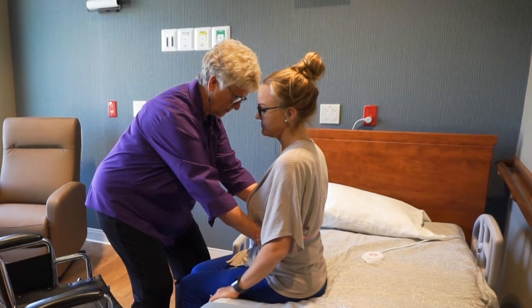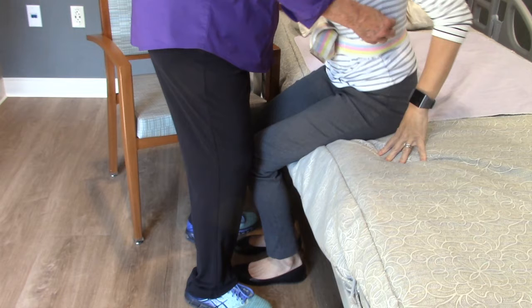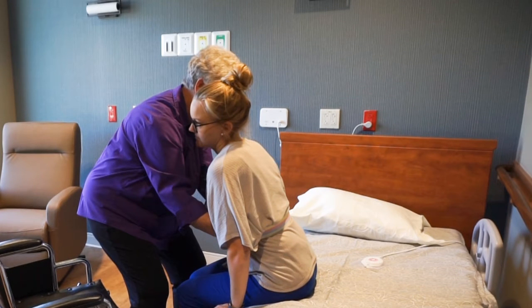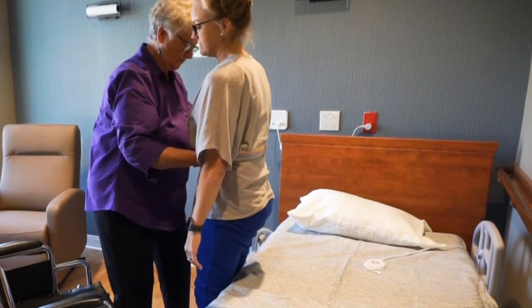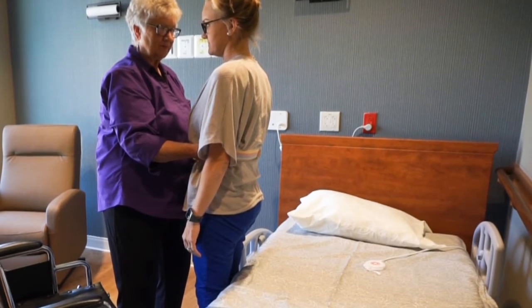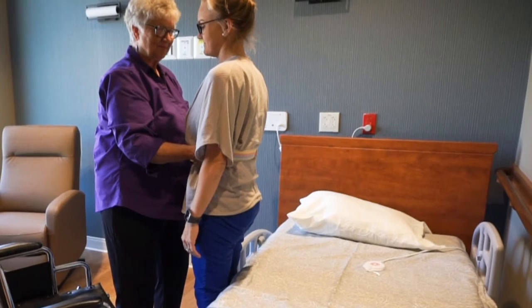Keep your back straight and bend your knees so that your shoulders are at about the same level as the person's. Put your knees on either side of the person's knees to help keep his or her legs steady. Ask the person to lean forward with their nose over their toes, then count 1, 2, 3, and on 3, have the person push with their hands off the bed as you both begin to slowly straighten your legs to stand up. Exert upward pressure on the gait belt with your hands, palms up, at the sides of his or her waist. Wait a moment to make sure the person is steady before continuing.